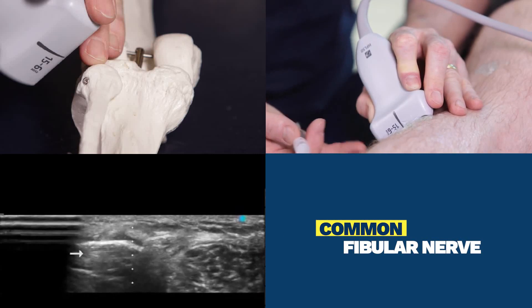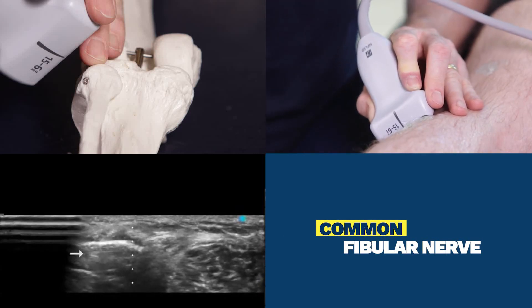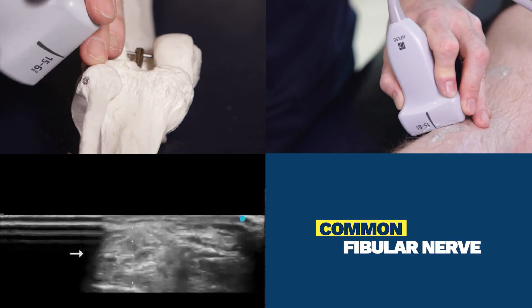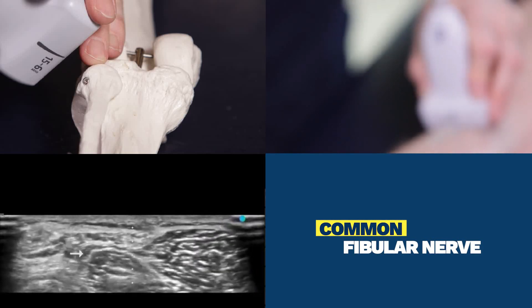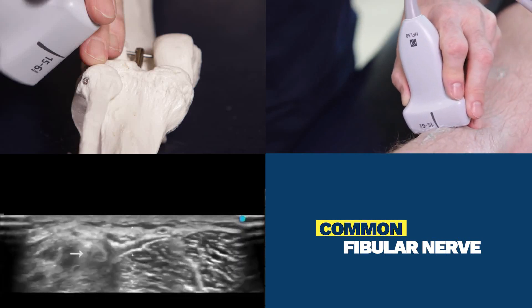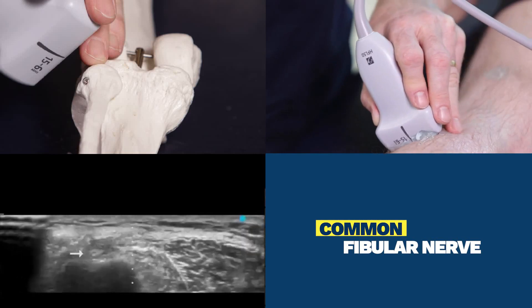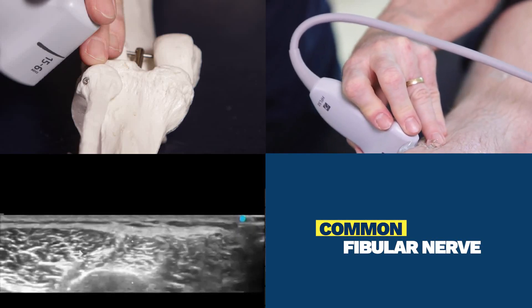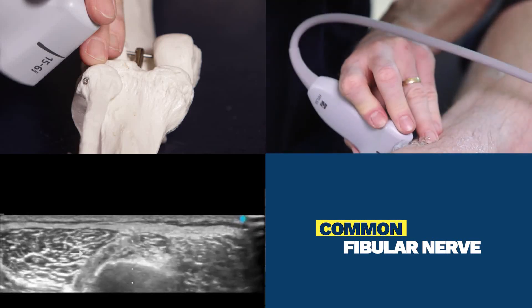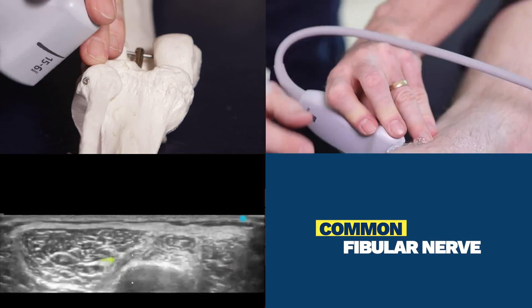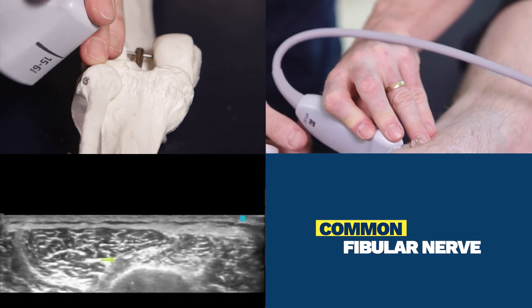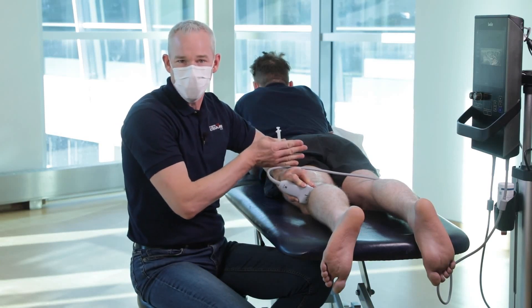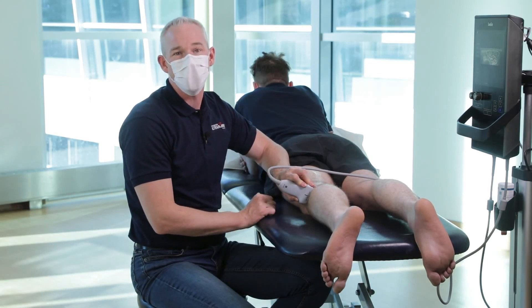If I wanted to continue distal and inject the common fibular nerve laterally, I would simply do a small rotation like this and continue to follow the nerve. I'll pick it up again just above the white arrow and follow it distal until it goes from posterior to anterior and we can see it on the lateral aspect of the fibula just there. That's how we would follow the sciatic nerve as it bifurcates into the tibial and the common fibular nerve, previously known as the common peroneal nerve.